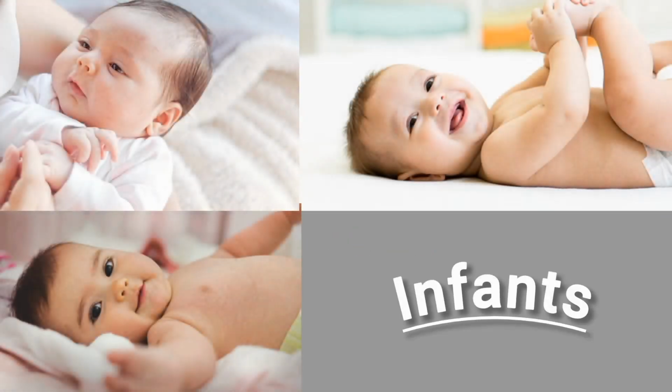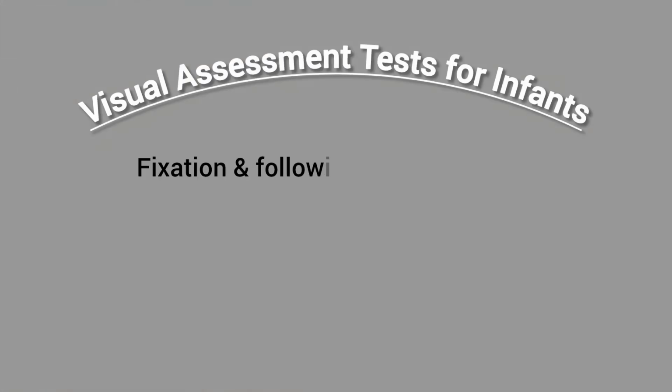So now, first of all, for infants, how can you check their vision or assess their visual acuity? We have different tests for infants. As you all know, newborns and up to the age of 1 year, a child doesn't speak. So in that case, you cannot assess vision by a subjective method.